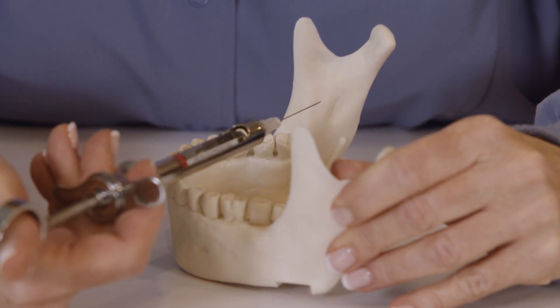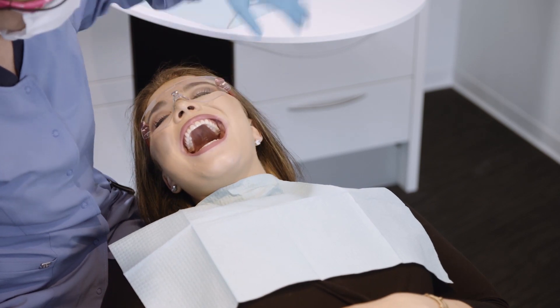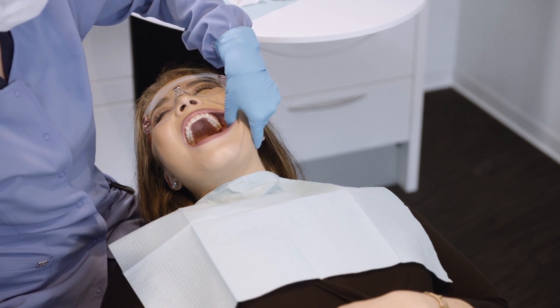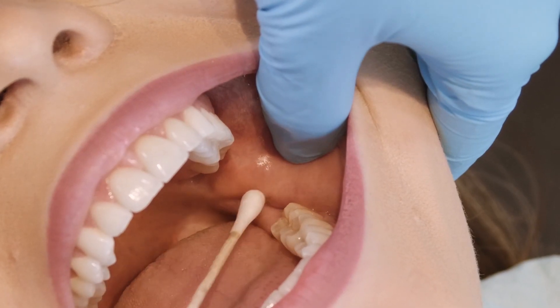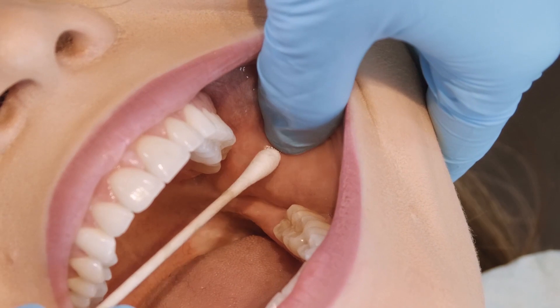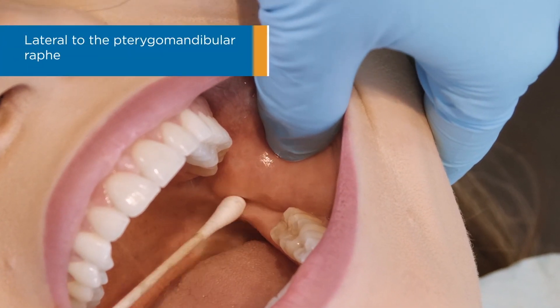Because of the lateral flare of the ramus, the syringe must be advanced from the contralateral premolar region for the needle to enter the sulcus. Clinically, the coronoid notch is determined by palpating the most lateral aspect of the anterior ramus. The thumb, kept parallel to the mandibular occlusal plane, is moved into position within the coronoid notch.